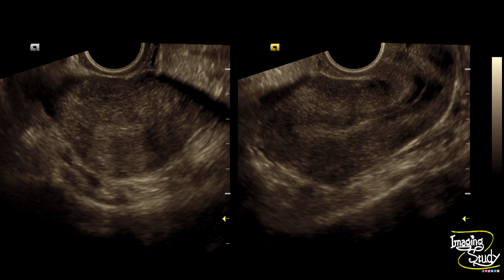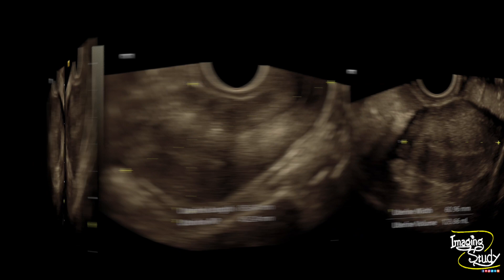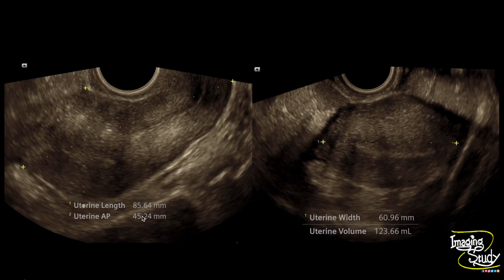Here are the longitudinal and transverse sections of the uterus. You can see the endometrium is getting bulged, which makes us look for endometrial abnormality. The measurement shows the uterus is slightly bulky, but not very prominent, as this is a very early case of adenomyosis.